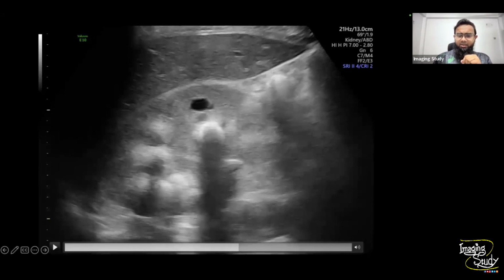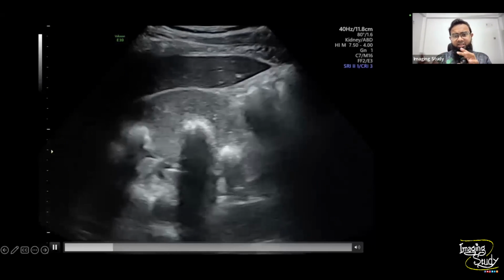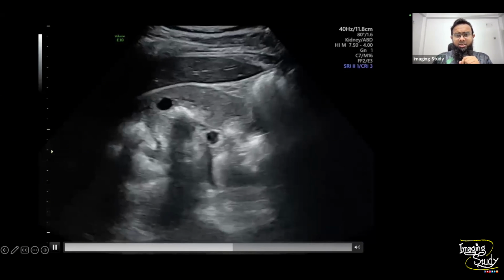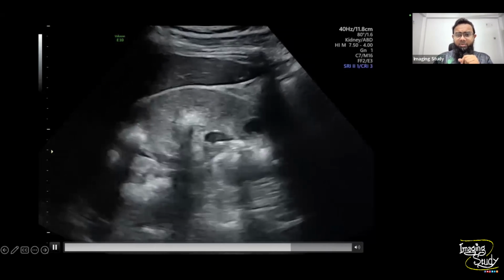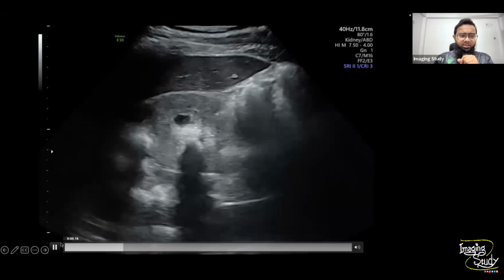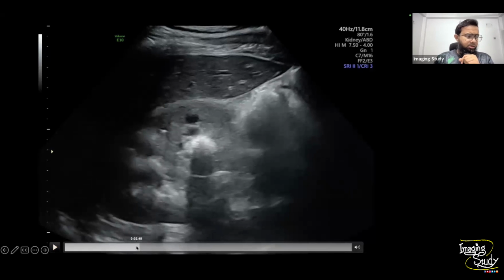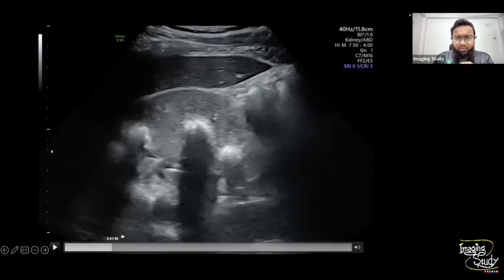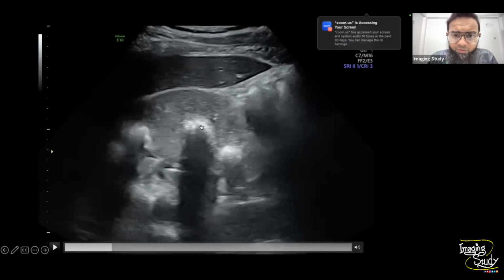So anyway, here we have changed the transducer. Now you can still see the echogenicity is more than the hepatic parenchyma. You can see multiple cystic lesions, and there is diffuse echogenicity. Let me freeze the image. Is it the calculi? If you look here, you can see some tiny flecks of echogenic structures. They're casting shadow. So these are actually diffuse calcifications.